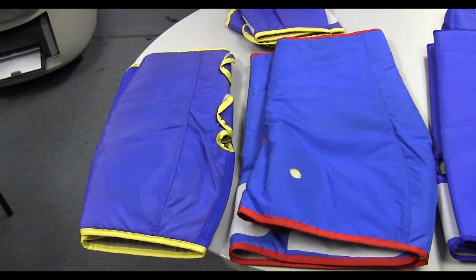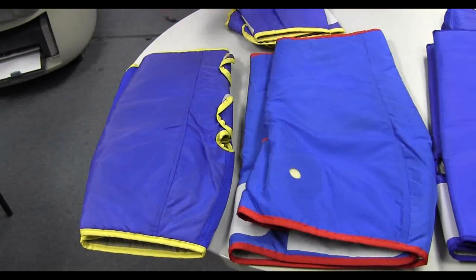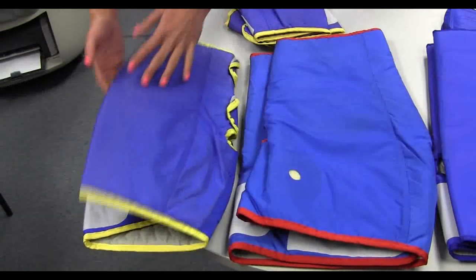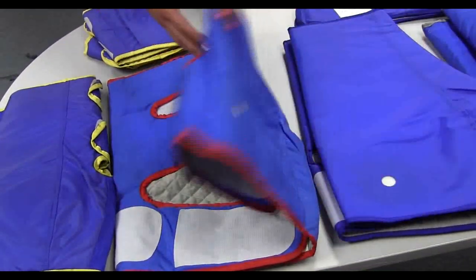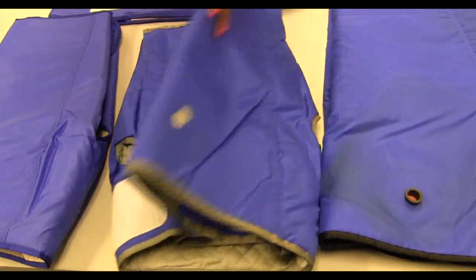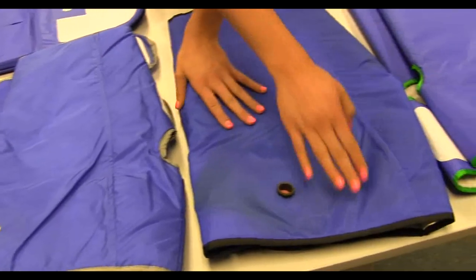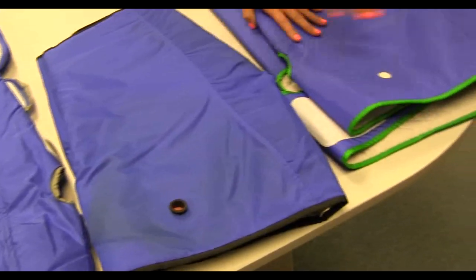Colored piping is used to differentiate cuff sizes. Extra small cuffs have yellow piping, small cuffs have red piping, medium cuffs have blue piping, large has gray piping, extra large has black piping, and double extra large has green piping.